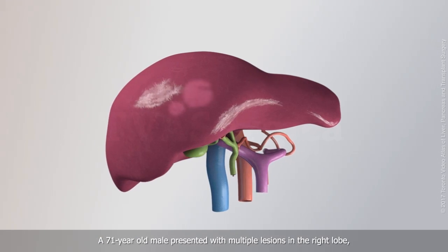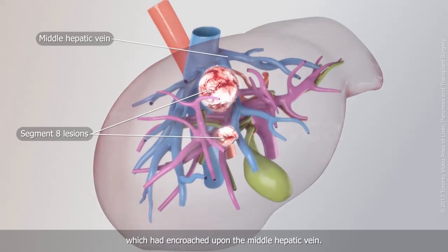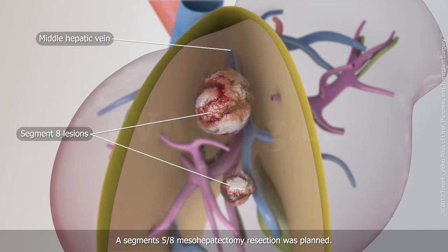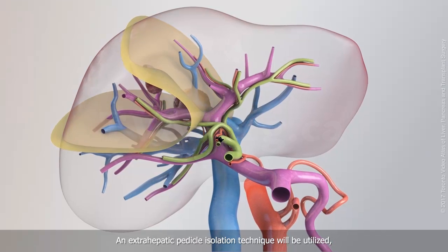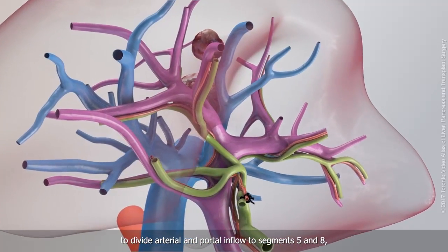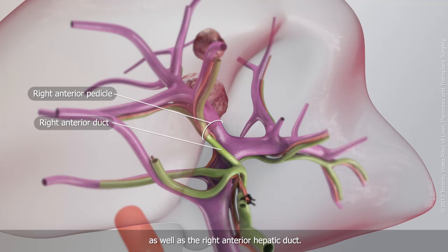A 71-year-old male presented with multiple lesions in the right lobe, which had encroached upon the middle hepatic vein. A segment 5-8 mesohepatectomy resection was planned. An extra-hepatic pedicle isolation technique will be utilized to divide arterial and portal inflow to segments 5 and 8, as well as the right anterior hepatic duct.